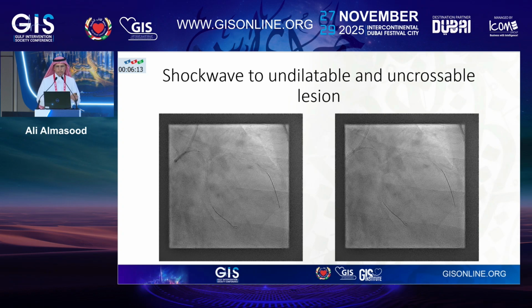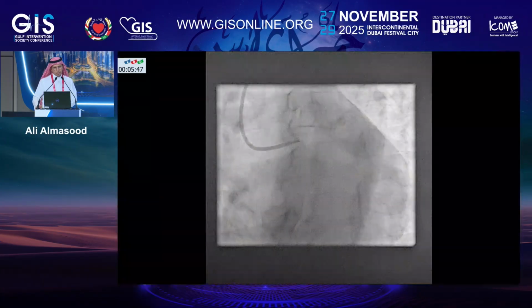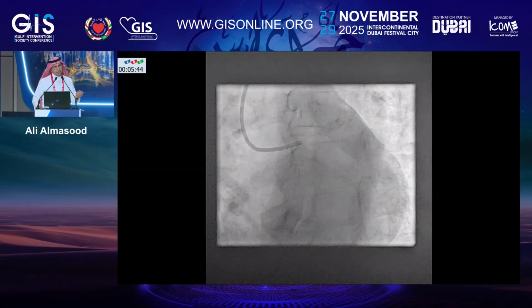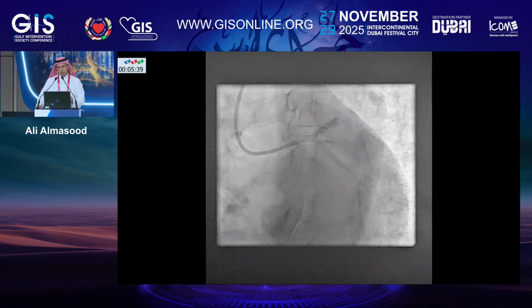We could use other techniques like using an extension catheter or an anchoring balloon. But what I did here, I pushed the shockwave balloon all the way, trying to engage the beginning of the stenosis or the calcification, and started shockwaves at that level. And with progressive dilation and sequential shockwave pulsation, we managed to cross that lesion. And then we did IVUS that showed cracked calcification. And this is the final result, a stent-like result, and we avoided caging this vessel or missing the ostium.